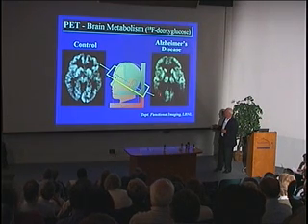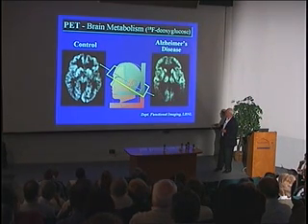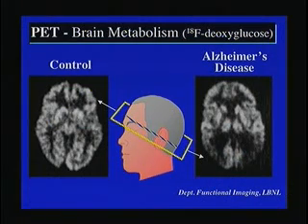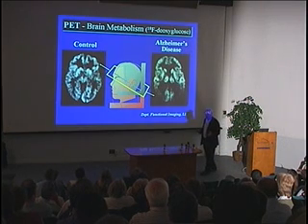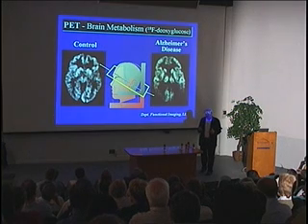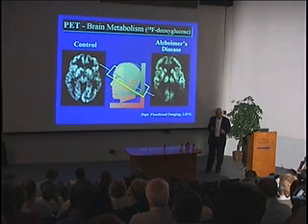disease. And here you see the distribution, or lack of distribution, of the glucose analog in these parts of the brain. All this tells us really is that glucose does not go into these parts of the brain. It doesn't tell us whether these parts of the brain are less than in the normal, or there's a hexokinase problem, a transport problem, or some other metabolic defect. So he's currently working on a large series of patients trying to detect things such as amyloid in the brain. So this is an old program that started in 80. Now we're 26 years later and maybe moving on to new ideas about the mechanism.